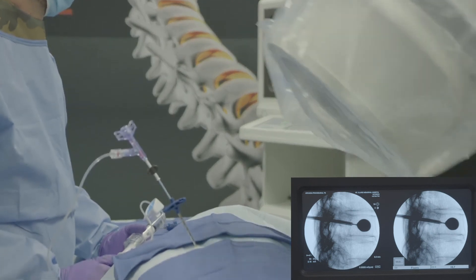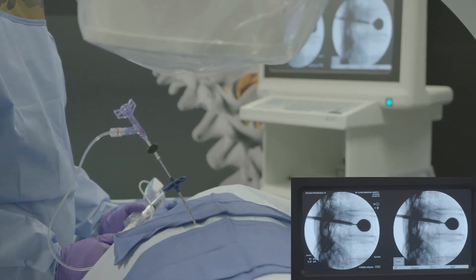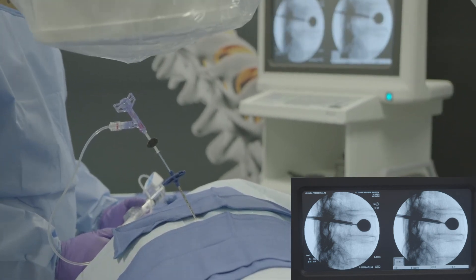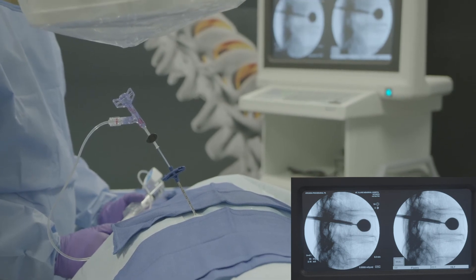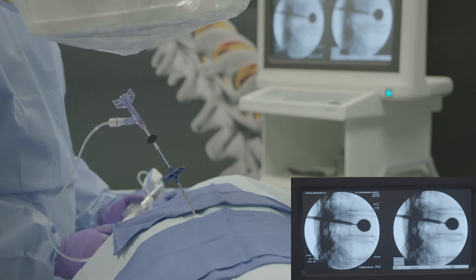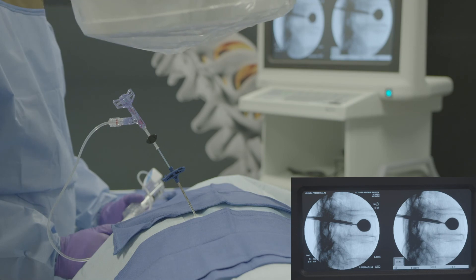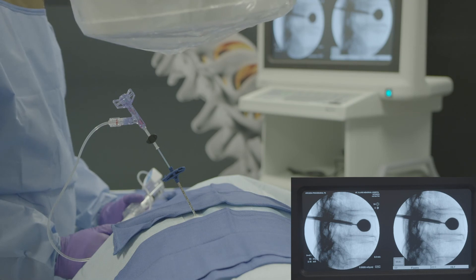Stop balloon inflation when the treatment goal is achieved, any part of the inflated balloon contacts cortical bone, or the maximum inflation volume and/or maximum inflation pressure have been reached.